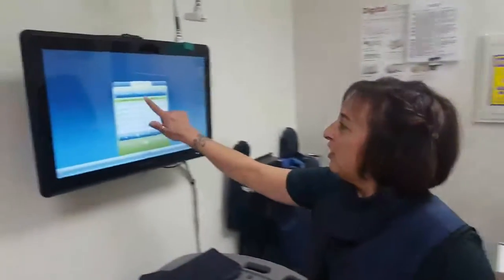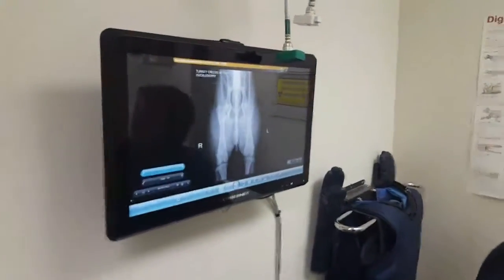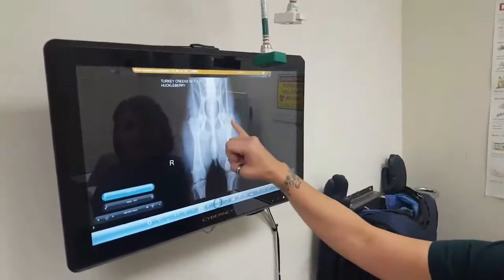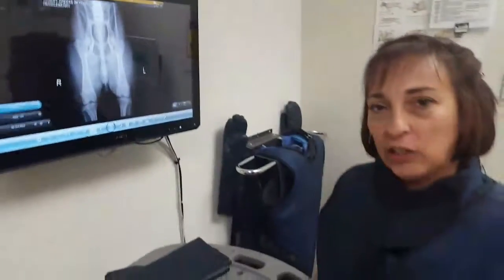Now we're going to see the results after taking the picture. Here is the image that we're going to be submitting to the OFA, and they're just going to be looking at this area in particular to make sure there's no signs of hip dysplasia.